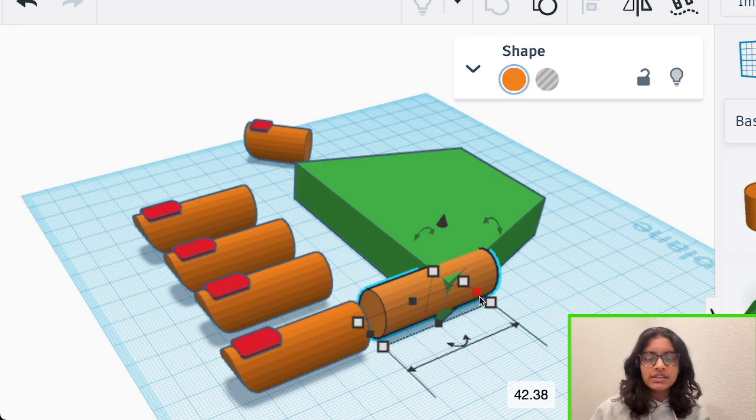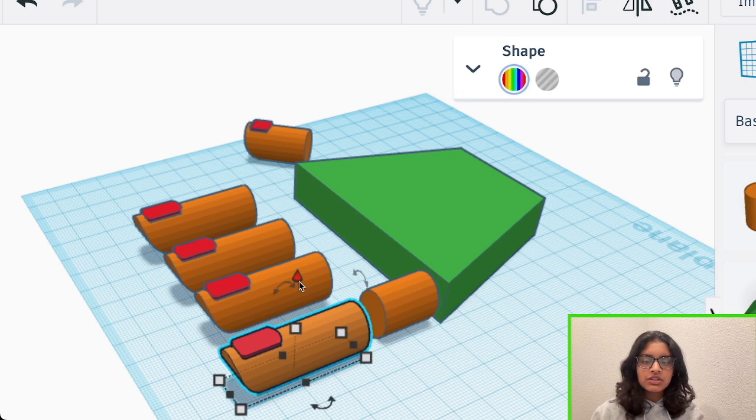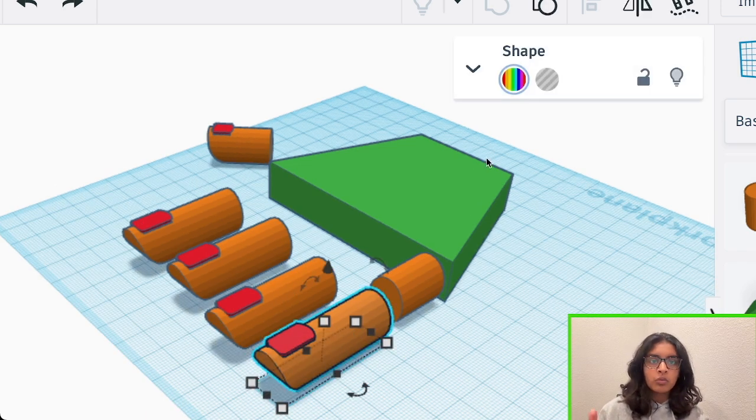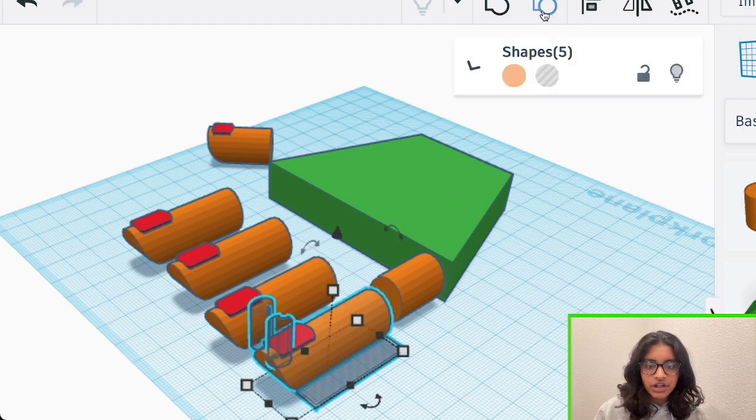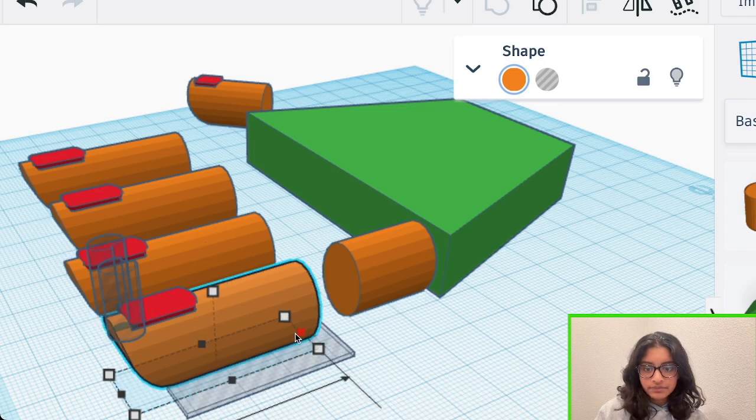After this, adjust the size of your middle joint to kind of look more like a finger. You might need to make each of your fingers a little bit shorter and make your middle joint a little bit longer. It's really up to you and how you want your hand to look. To make your finger design shorter without causing all of the other components to squish, you're also going to have to just ungroup these shapes and only click on the cylinder and shorten that.